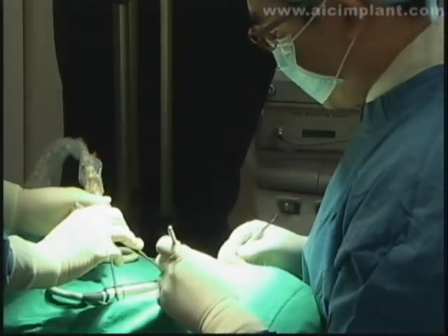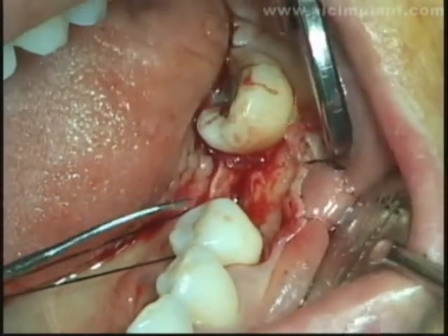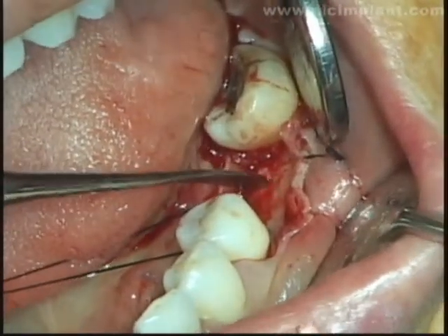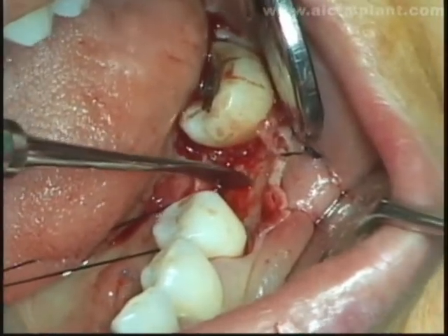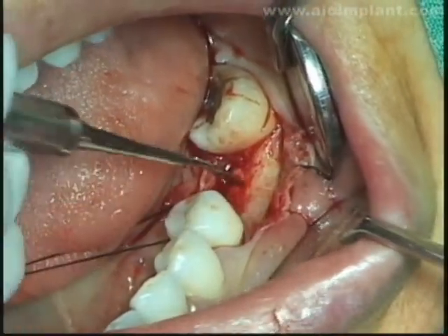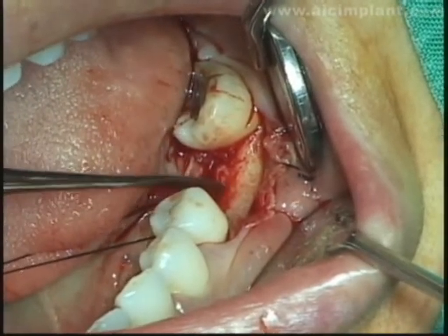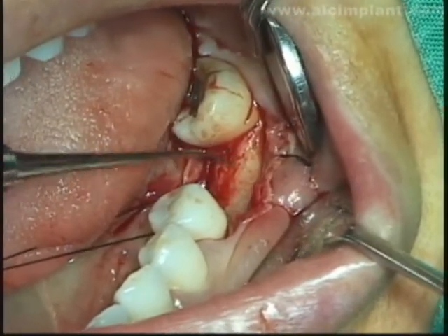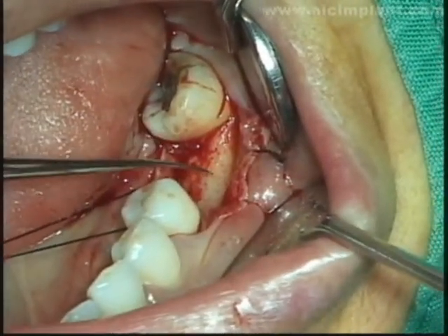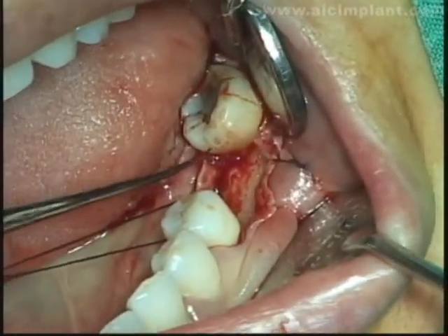When the second molar is tilted toward the mesial side, the implant can be installed in the exact position by using a stent. Without a stent, however, the implant is generally installed slightly closer to the second molar. That is because you tend to look at this line. And if you see this superficial area, the center seems to be this region. The implant must be installed in the actual center between this end and that end.